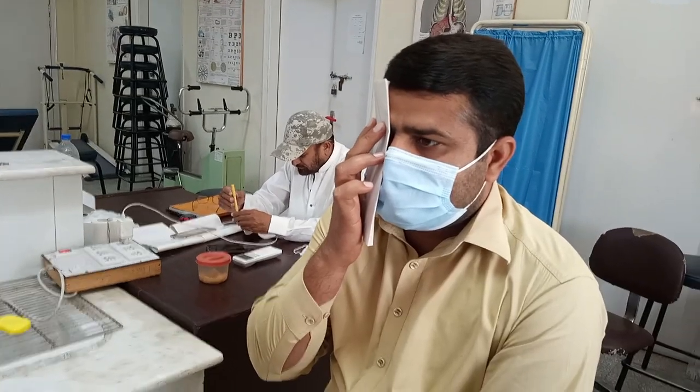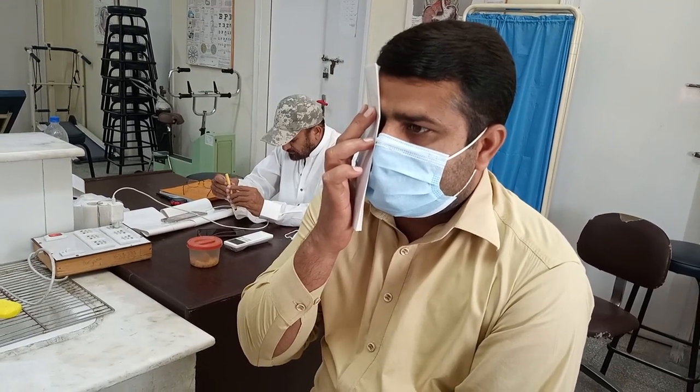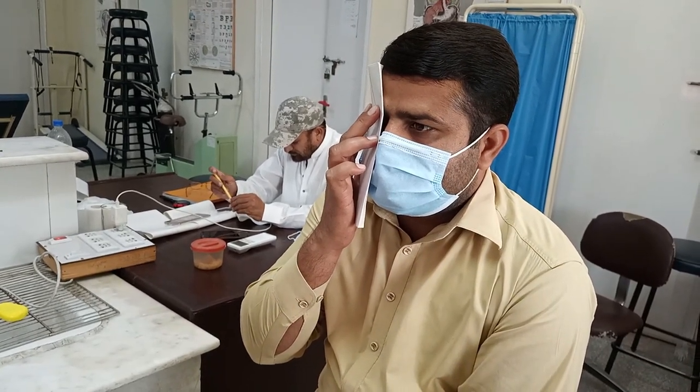We will repeat the same steps by asking the person now to occlude the right eye and start trying to read by the left eye.